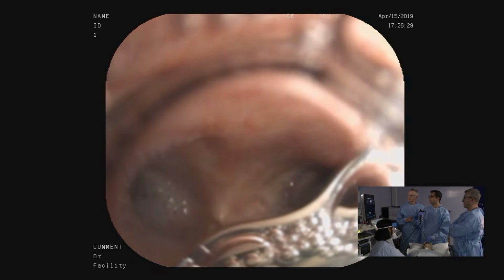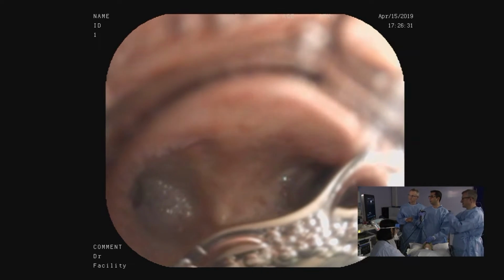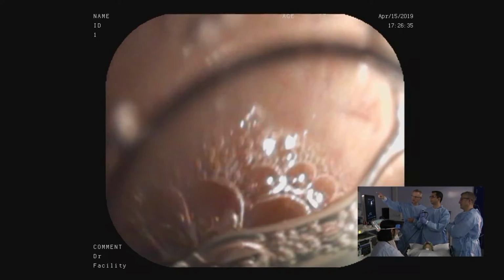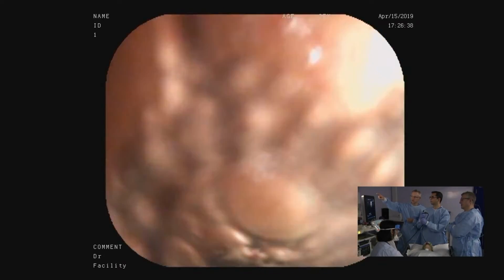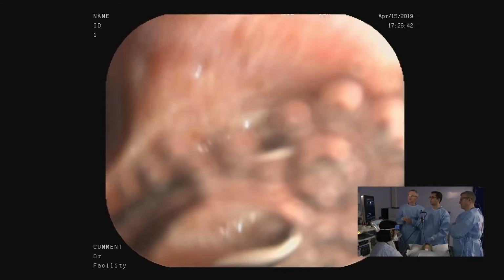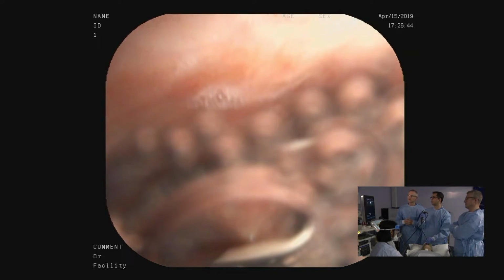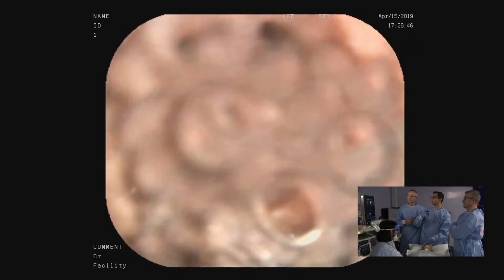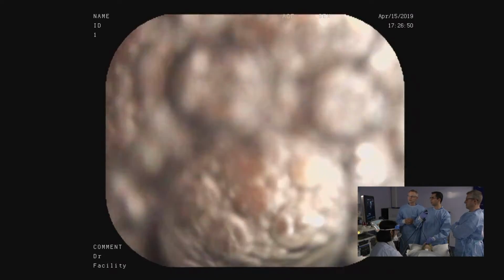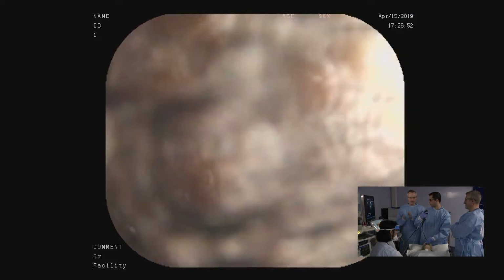Okay, so I'm back at the carina. So we looked at station 4L. Can you just highlight visually on the endoscopic view? You're just above the carina, about 1 or 2 cartilage rings, is that right? Yes, 1 cartilage interspace above, and then turn anti-clockwise to the 9 o'clock position, 90 degrees, and touch the left lateral wall of the trachea, and that's 4L.